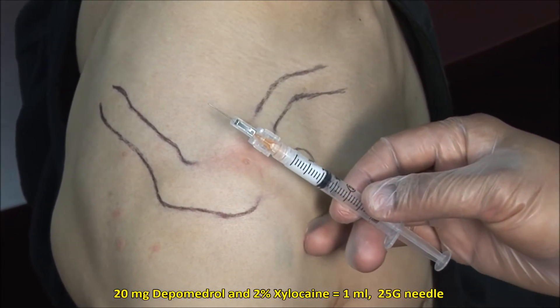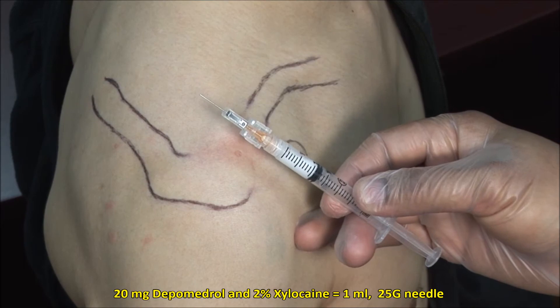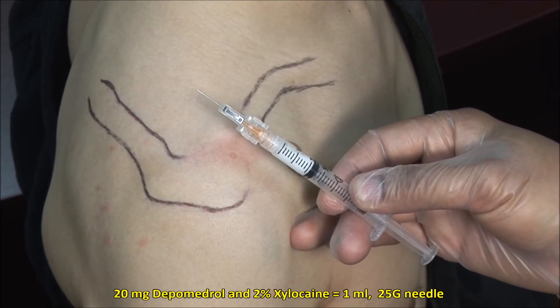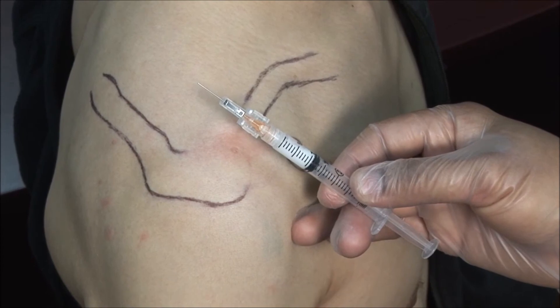Here, I have a mixture of 20 mg of Depo-Medrol mixed with 2% xylocaine to a volume of 1 ml, and I am using a 25 gauge, 5/8 inch needle.